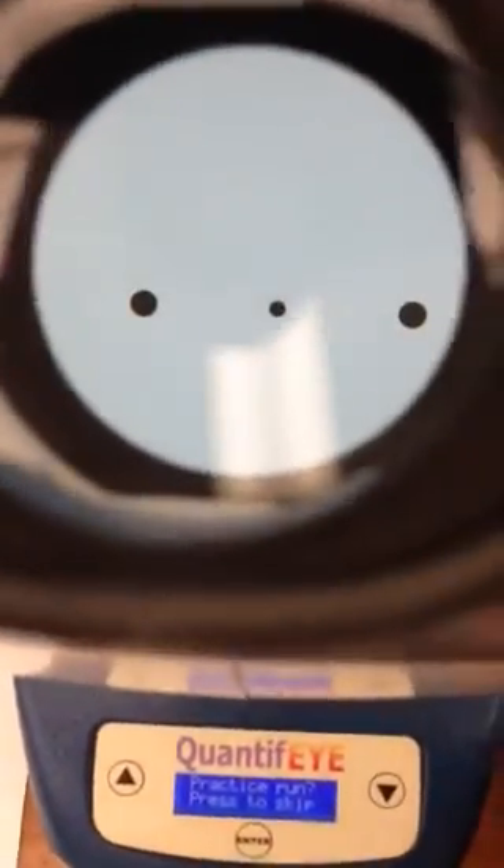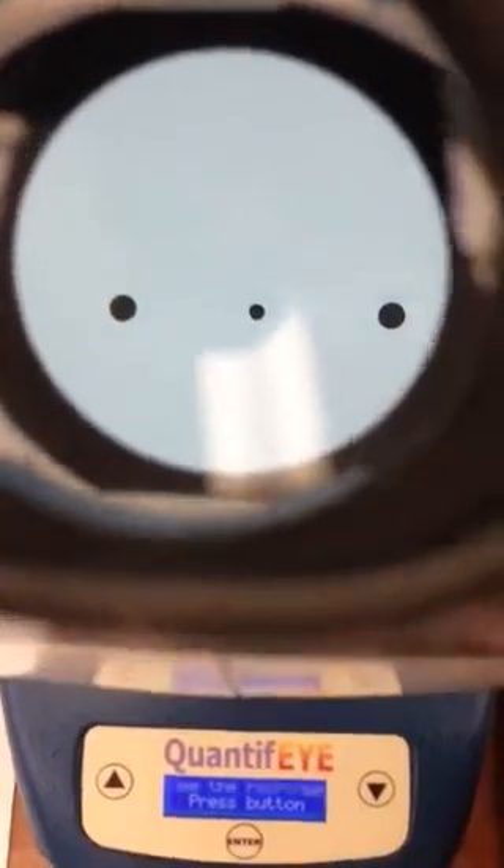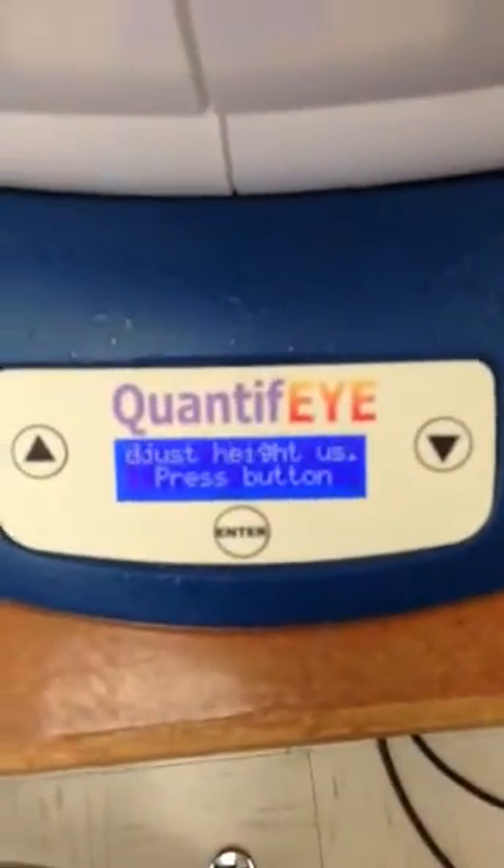So you press this button here, and inside the machine you should see three lights that will start out looking black. When you press the button again, you can adjust the height of the instrument by tilting it up or down. We don't have the laptop attached that you would use to enter patient demographic information. Press the button one more time to turn on the blue light.